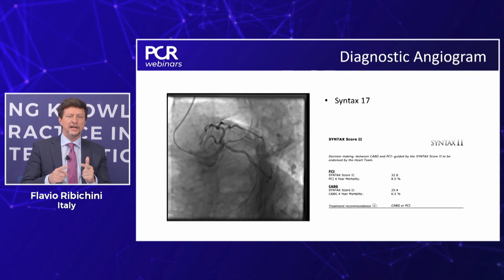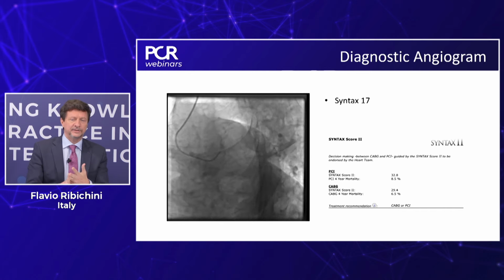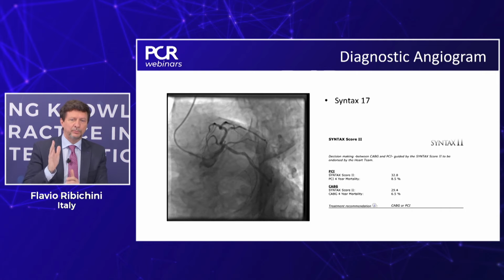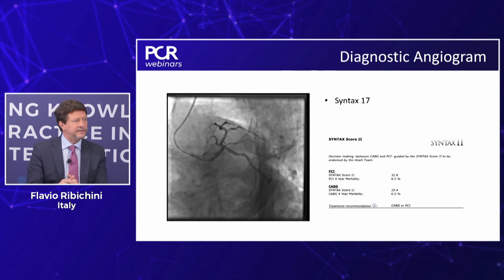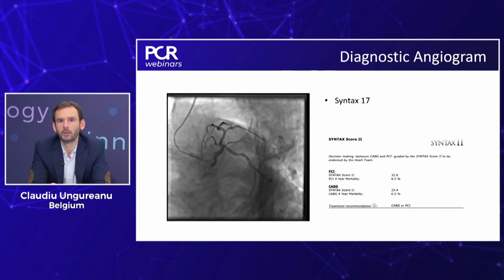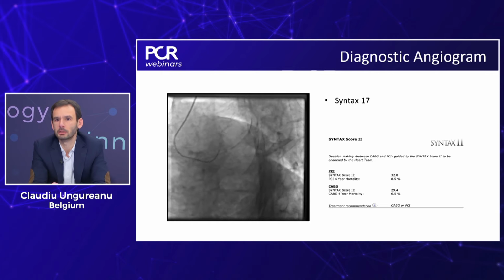You have the CT scan, you have a normal LV function, you have an angiographically highly calcified vessel with moderate MLD because it's not a very tight lesion, with proof of ischemia on FFR. Are you ready to go with a direct stent in that lesion? With the direct stent, maybe not, but actually I ask myself where to place my distal stent and exactly how I will deal with this proximal and ostial LAD.